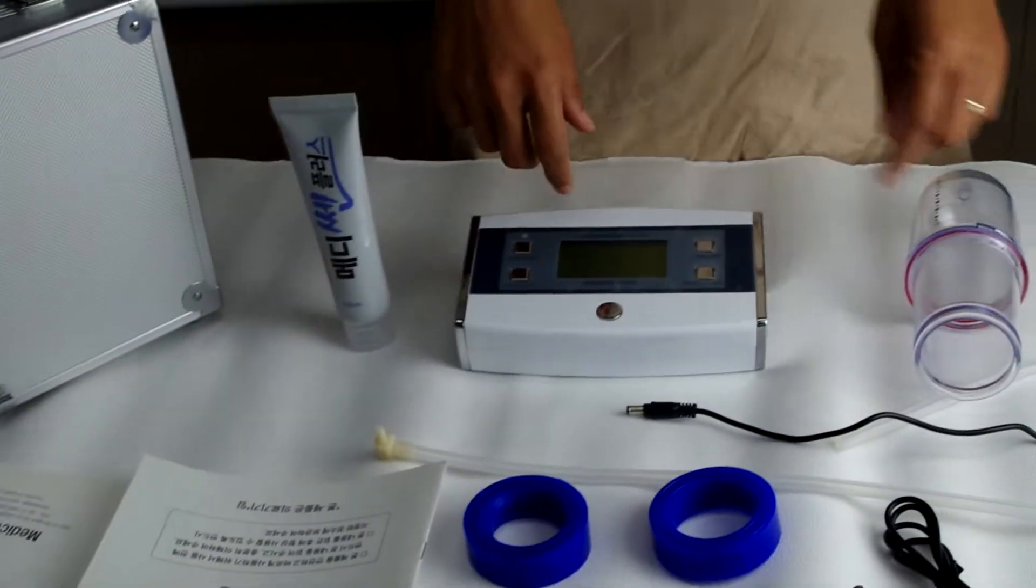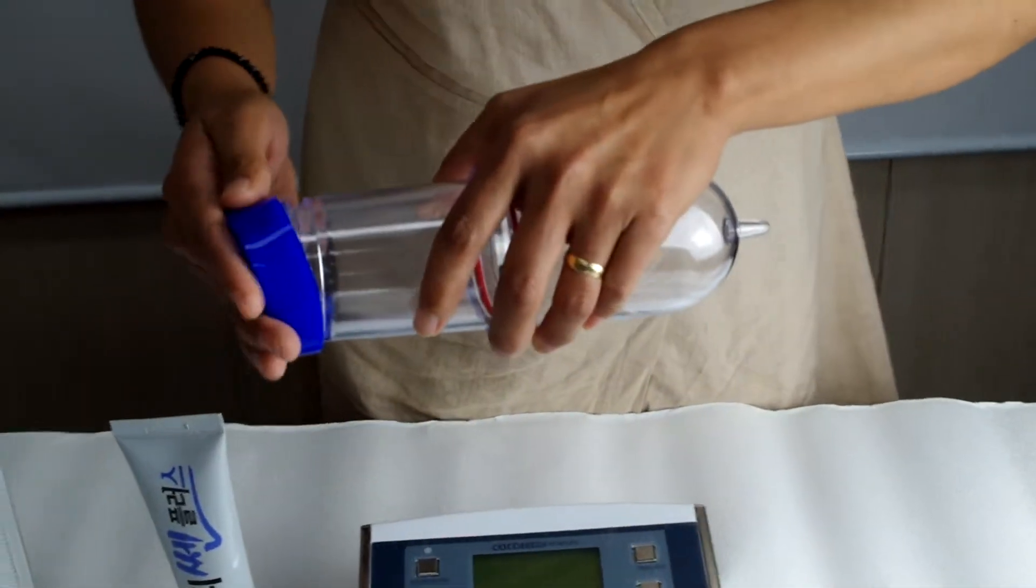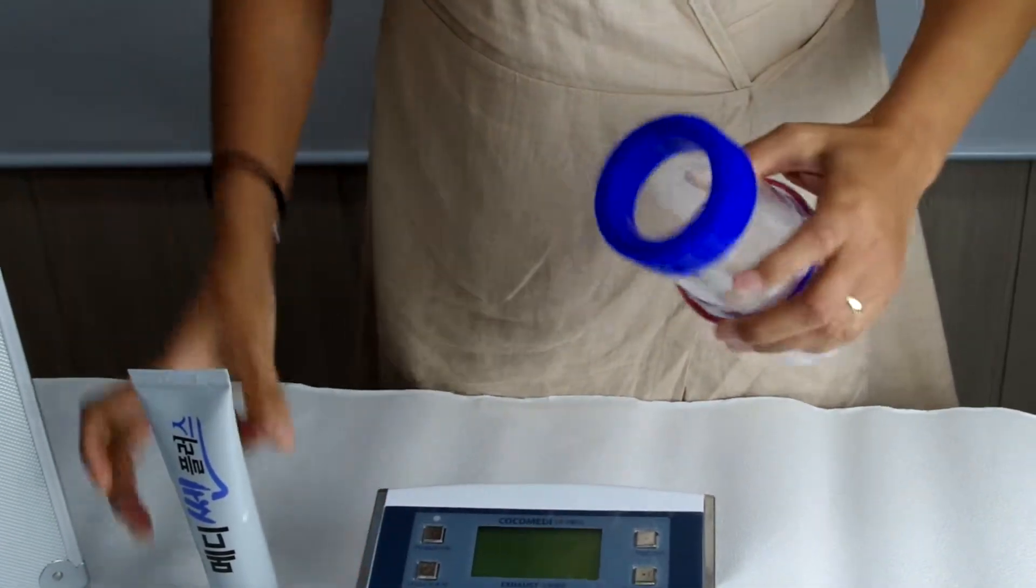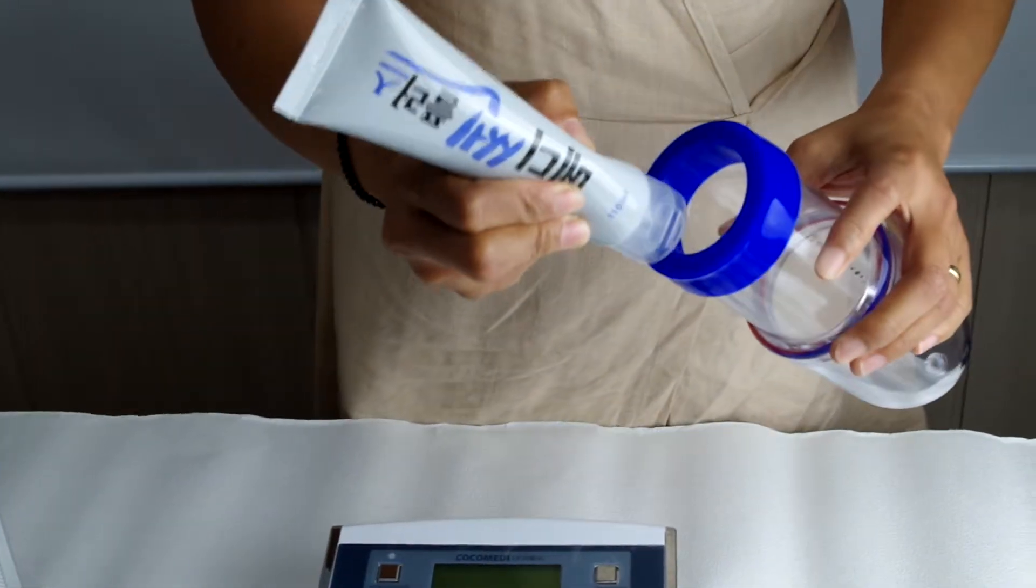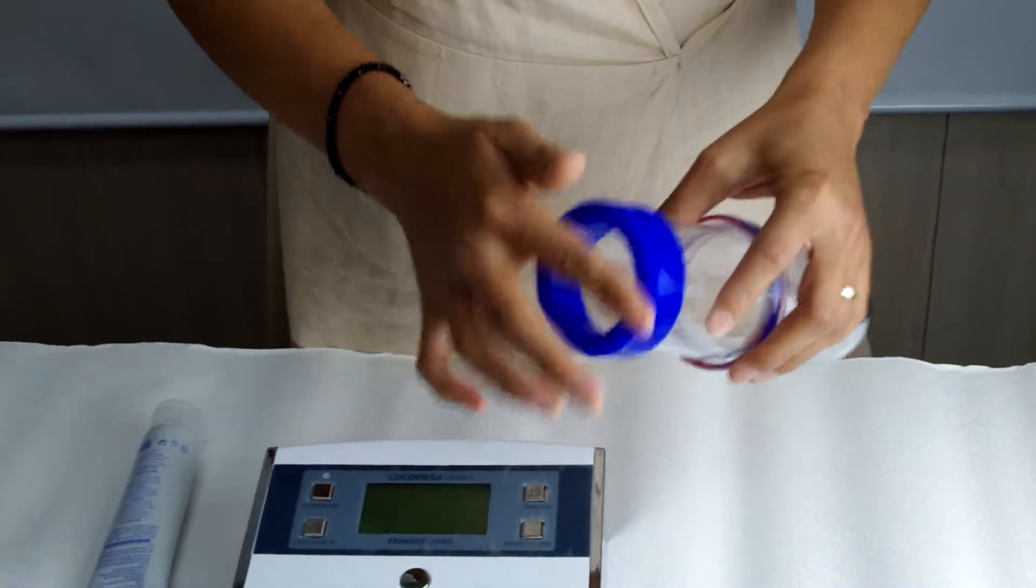First, you have to install the cylinder and the protector for everyday use. Put the gel on the top and inside of the protector and spread it.